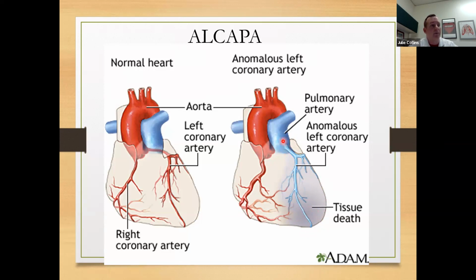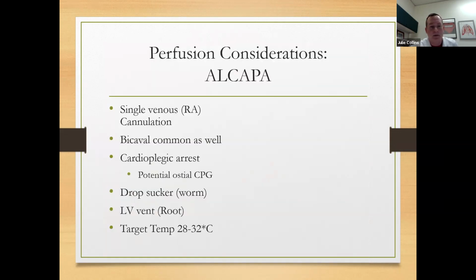But you're also talking about a pediatric case where ostial perfusion is really difficult. You're talking about really tiny ostia, and it's not always doable to selectively perfuse the coronaries like you do in bigger kids or adults. So the more cooling would give you added cardioprotective effect.